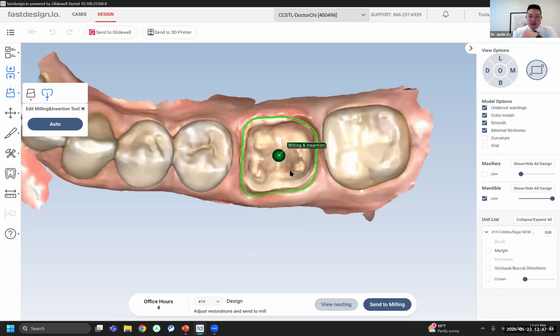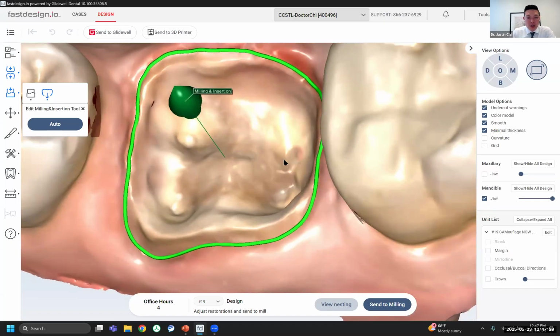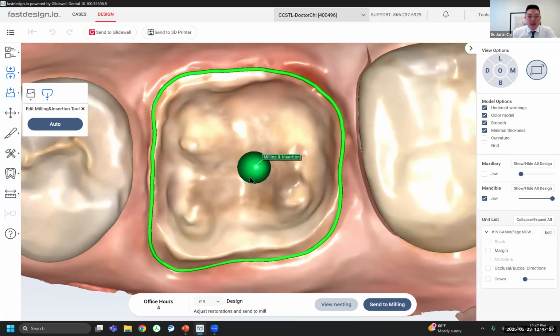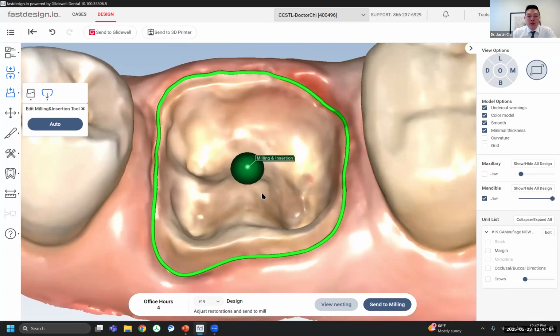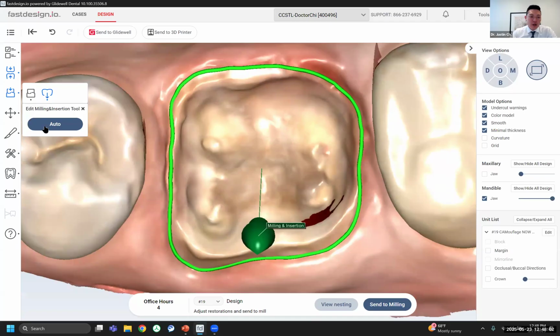Now, what should we be looking for here? By default, the software minimizes undercuts in the prep. That's how it's currently written. It's looking at the prep mainly and calculating the position that is the smoothest straight down onto the prep. You can see into the walls, if there were any undercuts, highlighted by a little bit of red. If we move this, you'll see more red forming in a certain zone because, since we're moving it to the buccal, we're telling it to insert the crown, or mill it, from this buccal position. Viewing from that insertion position, there are areas that become hidden. Those are the undercuts.